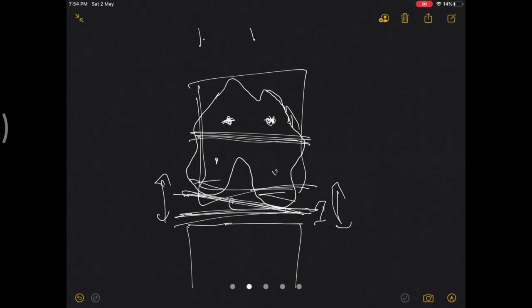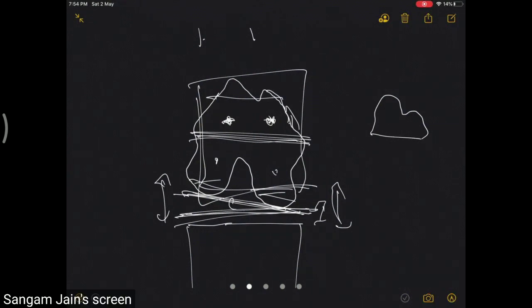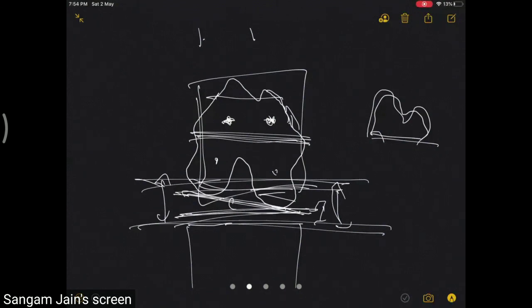That is one. And the second thing is you have something called the grand piano sign. If you have taken an external rotation cut, you will be cutting more of the anterolateral aspect than the anteromedial aspect. Then you have this grand piano sign, and once you take the cut, you just eyeball it. It has to be parallel to the proximal tibial cut. Okay, so these are some of the checks which you can use to assess whether we have taken a proper component rotation or not.